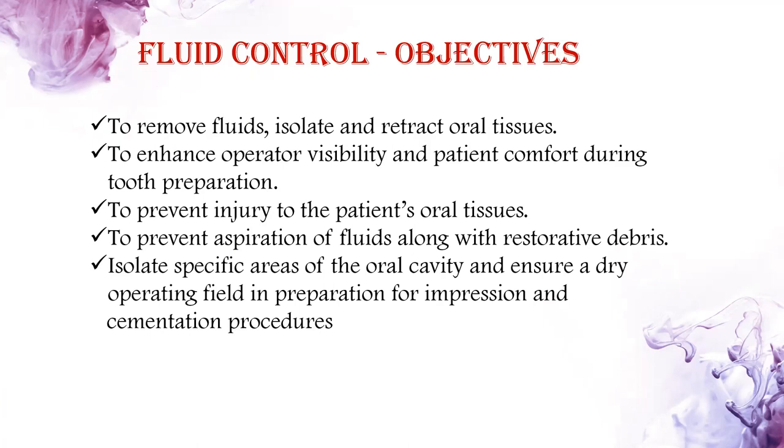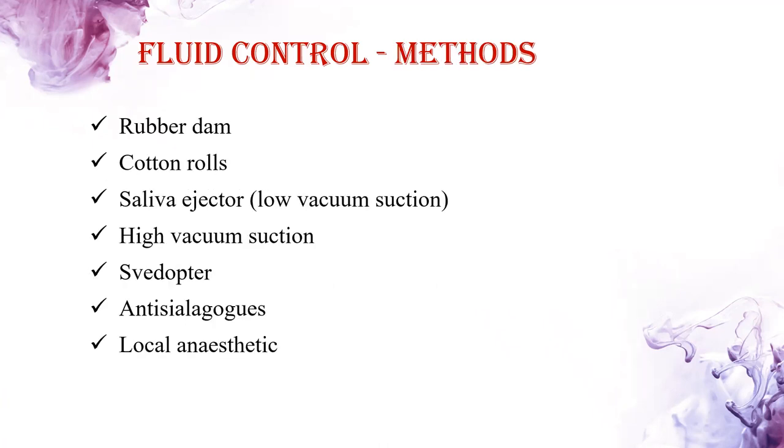Fluid control objectives: to remove fluids, isolate and retract oral tissues, to enhance operator visibility and patient comfort during tooth preparation, to prevent injury to the patient's oral tissues, to prevent aspiration of fluids along with restorative debris, isolate specific areas of the oral cavity and ensure a dry operating field in preparation for impression and cementation procedures.